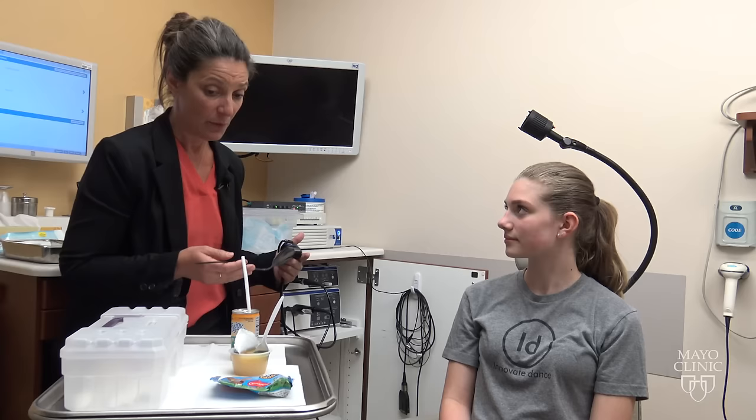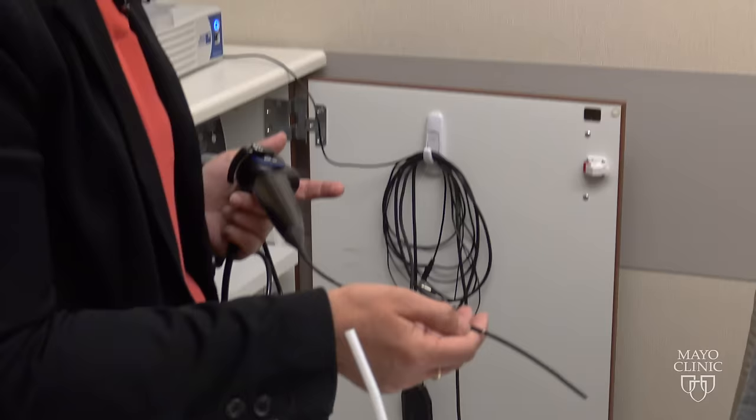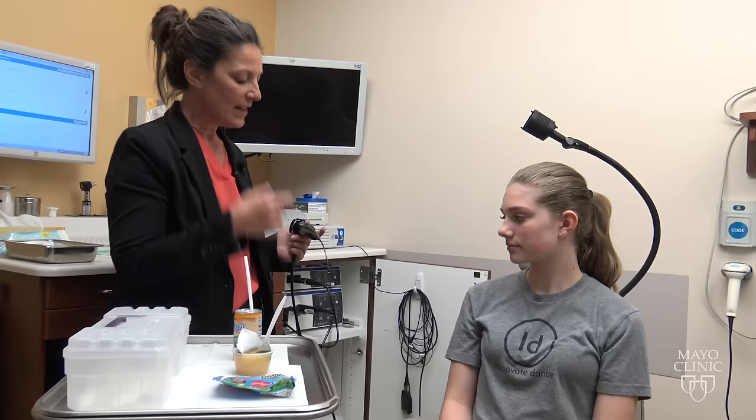We're going to be doing a type of swallowing evaluation where we put a camera in your nose and we give you different consistencies of food items to swallow and watch you swallow those. This is the camera we're going to use. It goes in your nose about this far, just a little bit past that white line. There's not much space between your nose and your throat so it doesn't have to go in very far.